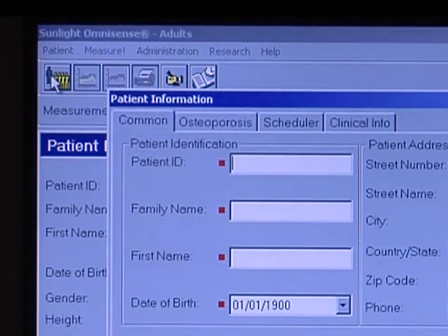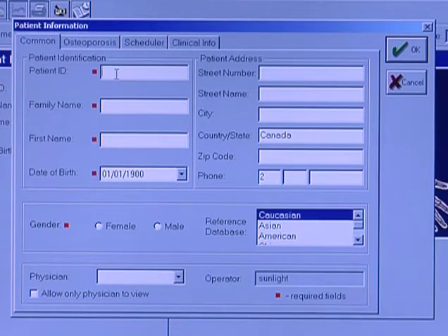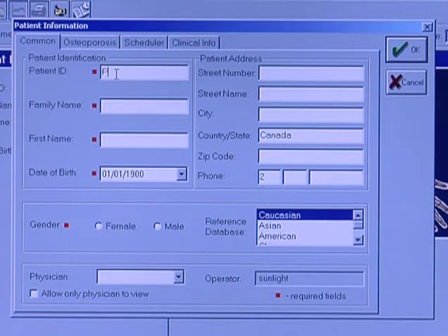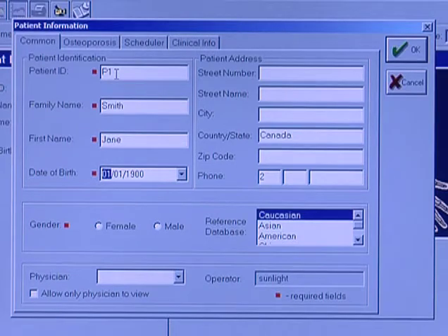The information you're absolutely going to need to run a test is denoted by the red squares. You see patient ID, and that's actually a unique identifier. So for our purposes today, we're just going to use P1 for patient 1. Family name is Smith, S-M-I-T-H. The first name is Jane, J-A-N-E.